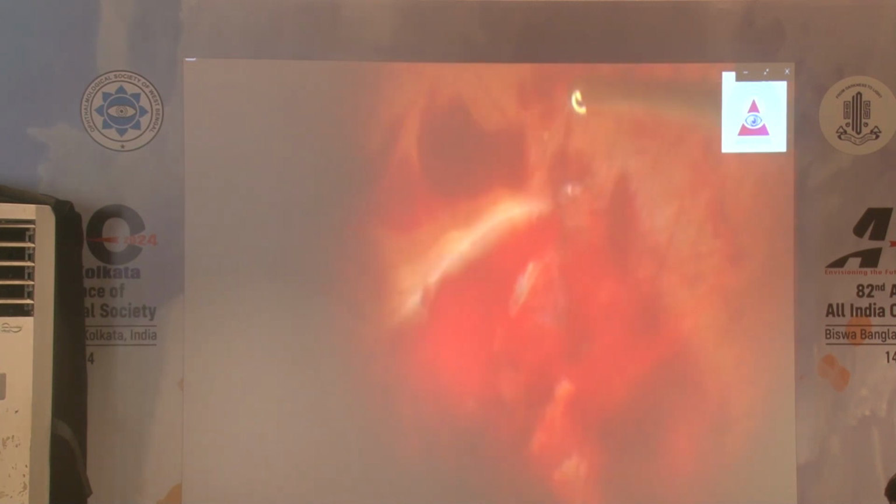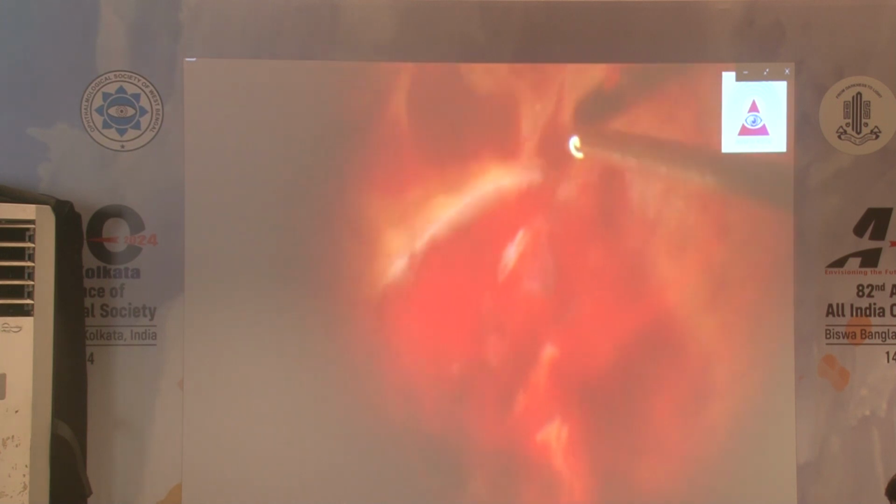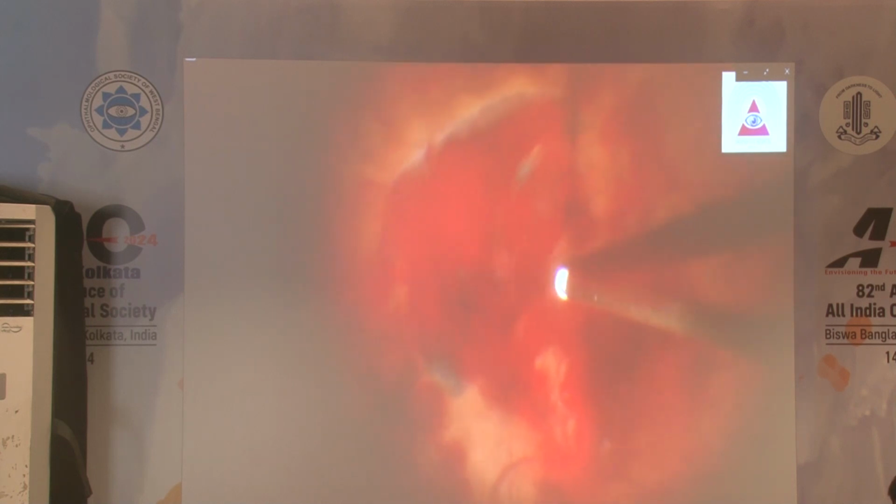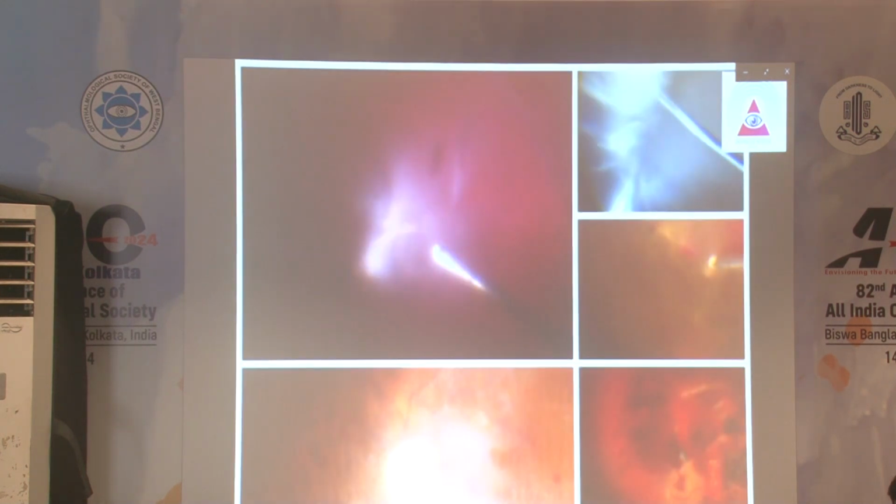In these cases you also encounter a lot of membranes which are adhered to the retinal surface. You have to be careful in removing the membranes along with the PVD. So to conclude, although vitreous hemorrhage cases are considered fairly easy, vitreous can show different shades, and proper preoperative and intraoperative evaluation is important for a good surgical outcome.